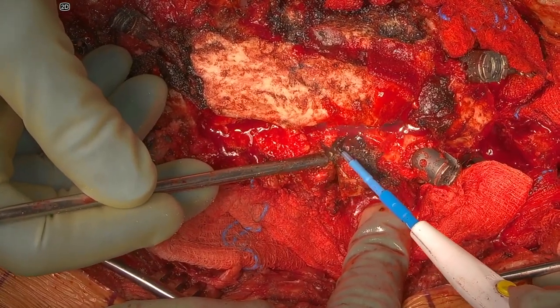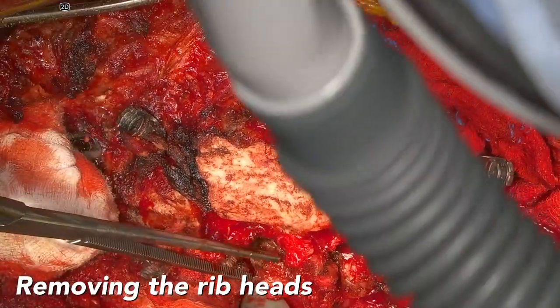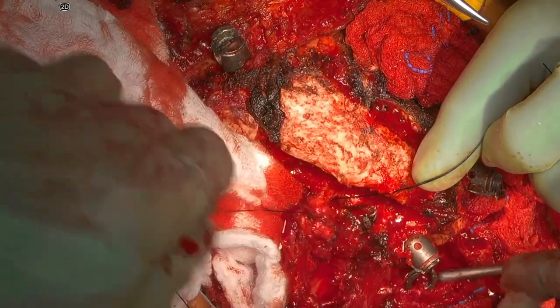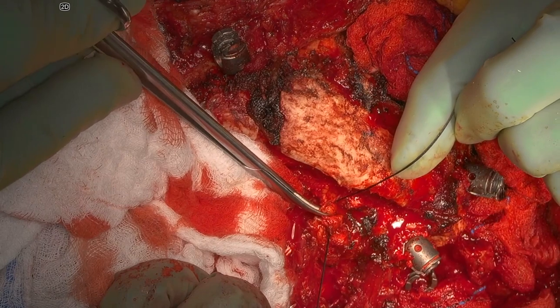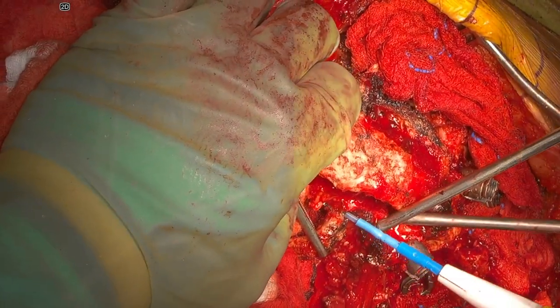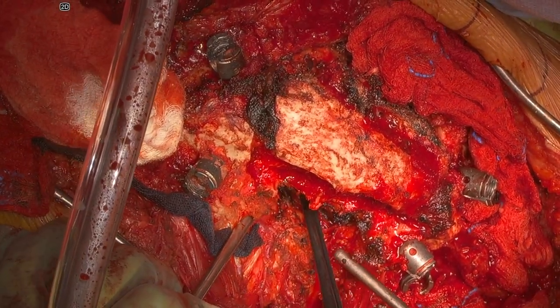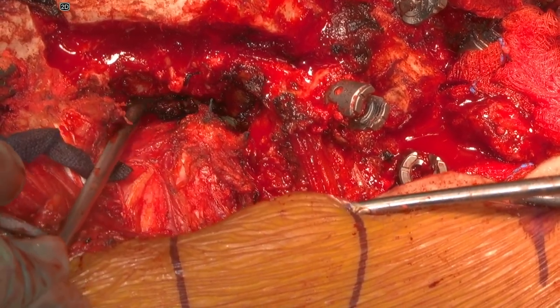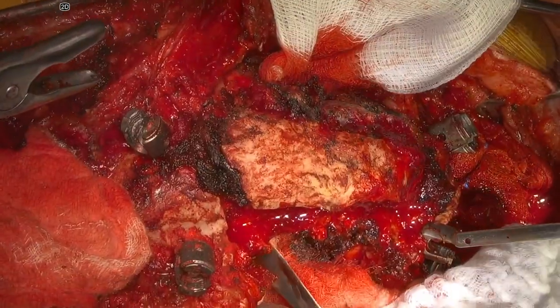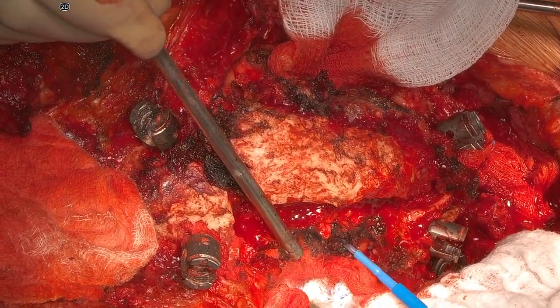The rib heads are then isolated. The pleura is bluntly dissected off the rib heads, and the rib heads are then removed sequentially. The nerve roots are identified and dissected, then sacrificed after tying off the proximal and distal ends. The rib heads are now removed from both sides. The lateral portion of the spine is approached, with hemostasis achieved using bipolar cautery. Blunt dissection is used to expose the anterior portion of the spine, and all soft tissue is dissected away. Sponges are used to protect the soft tissue anteriorly.